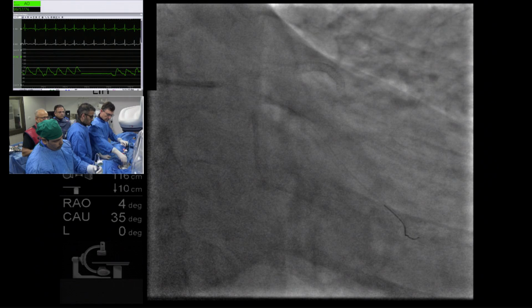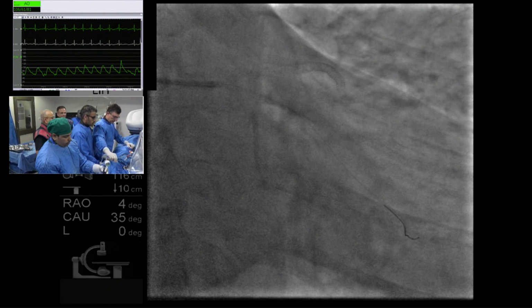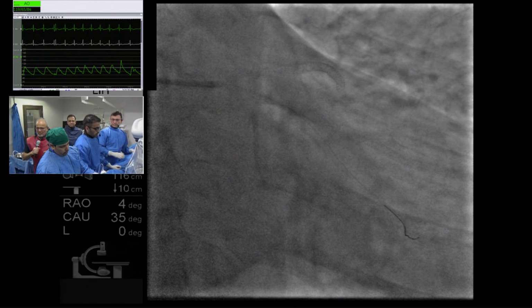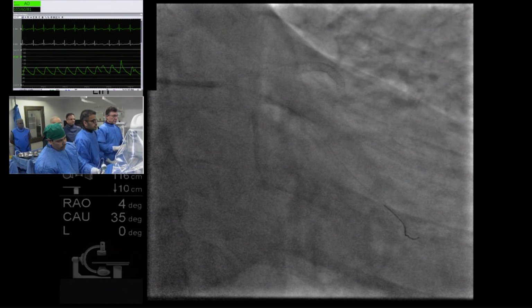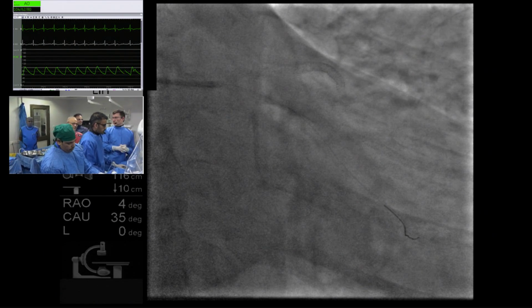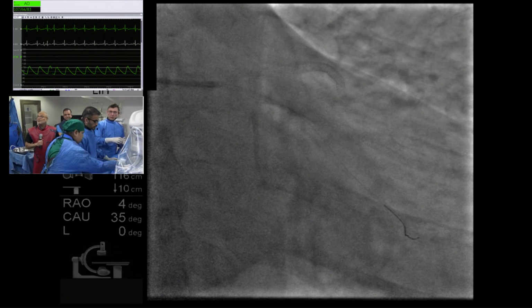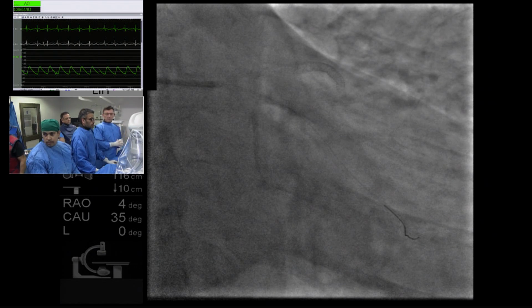A wire should not come out, because Mauricio is very experienced, he can rewire. Sometimes, if you have created dissections, it can create a problem. And this is one territory which can give acute MR if it occurs. Yeah, especially because the vessel looks so normal, these are the ones that dissect the worst and then they spiral. Because when you have more atherosclerosis, the plaque will stop the dissection.